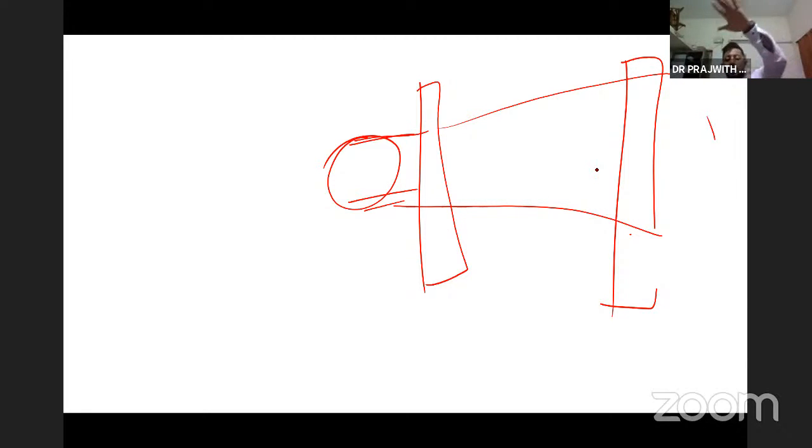Second, as I showed you in the example of shadowing, as I go away from the film, the shadow becomes less and less bright. That is very important. So as I keep any structure away from the film, it becomes less bright. Now if I keep a rib closer to the film, it becomes brighter.